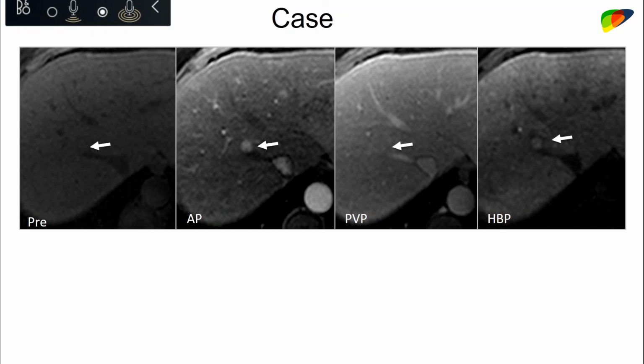I think this smaller nodule is nasty also. Well, if there are other HCCs, I don't think it would change my suspicion, the way I look at this nodule. This nodule, I believe, is an LR4. I believe it's very likely to be an HCC. It was an HCC, that's ultimately what it turned out to be.